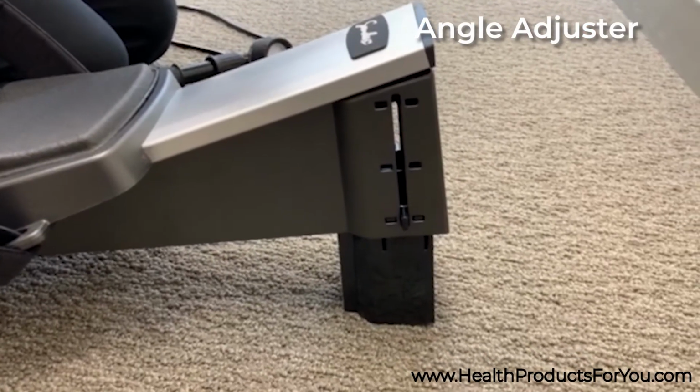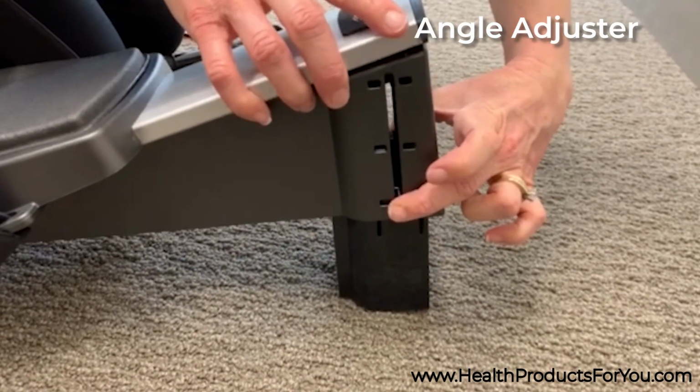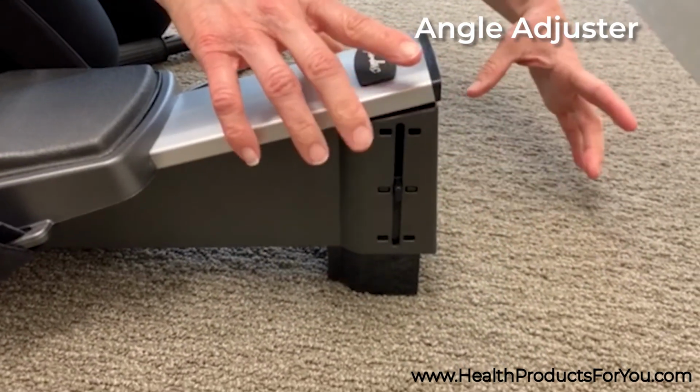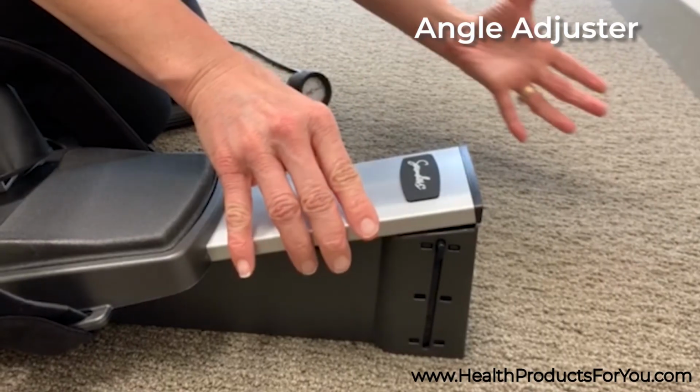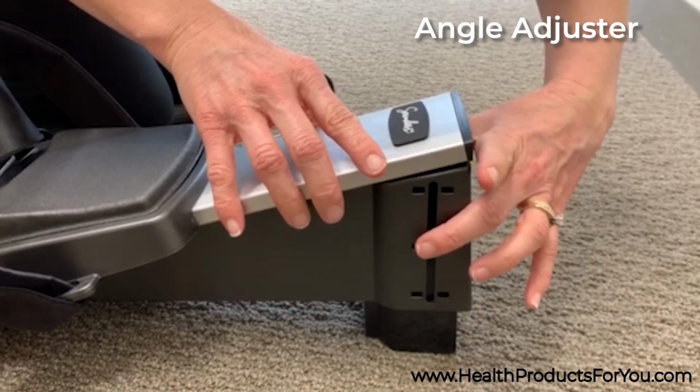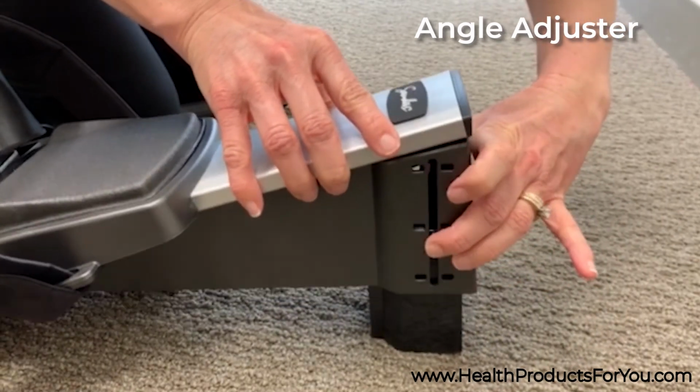An angle adjuster. If your healthcare provider did not specify the angle of pull, leave the angle adjuster in the top position. The top position is 15 degrees, the middle is 20 degrees, and the bottom is 25 degrees.